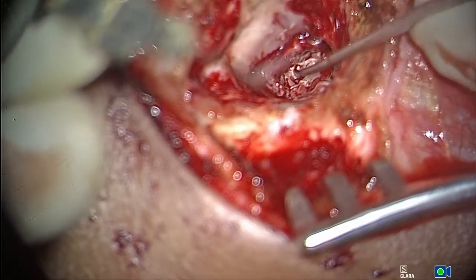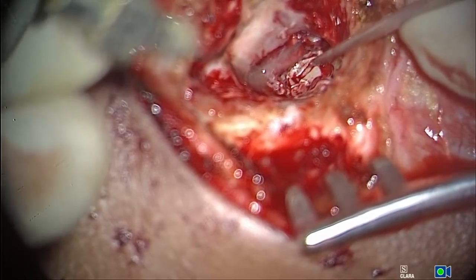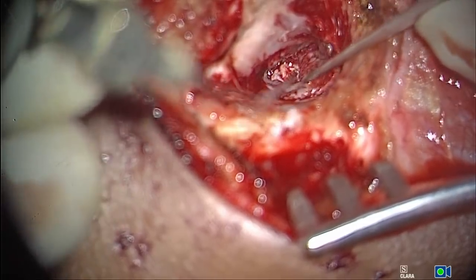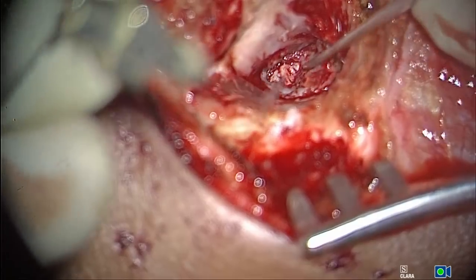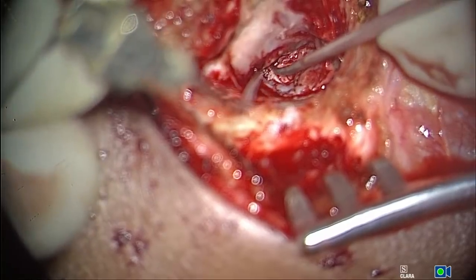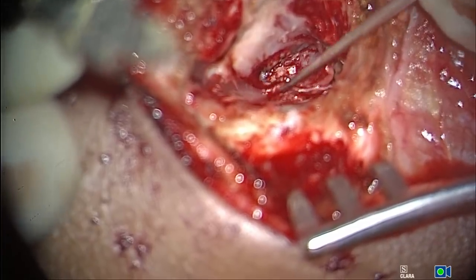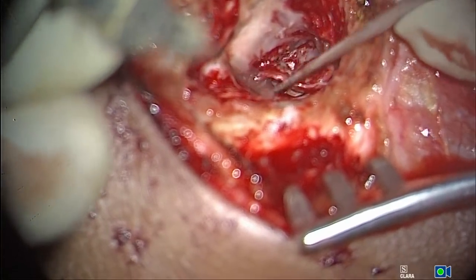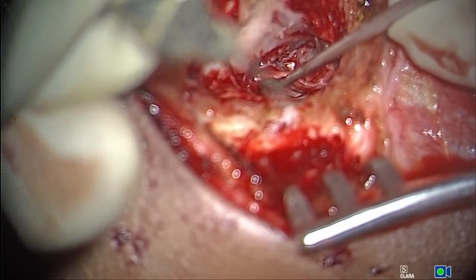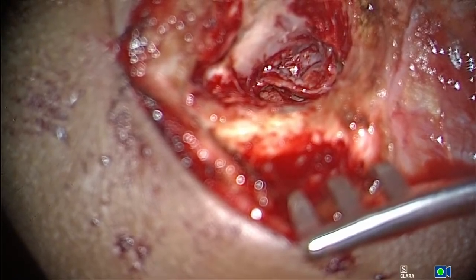Lovely. Kept it right underneath the malleus, and now I'll place it right there. You can see how the perforation has been completely closed. Can you all appreciate that? Now again, I'm going to place a little gel foam for me. If I do that, if the handle is actually going right towards the promontory, yeah, give me gel foam.